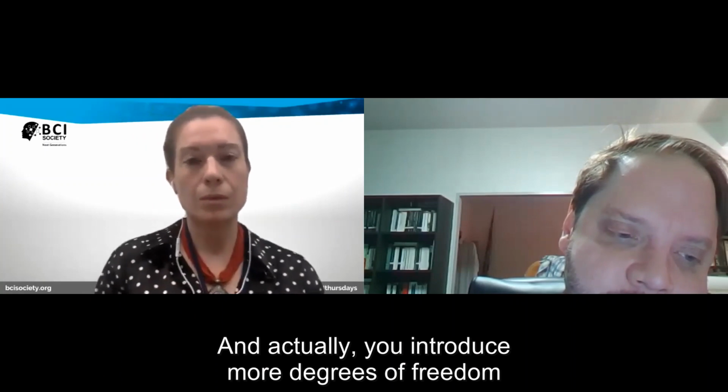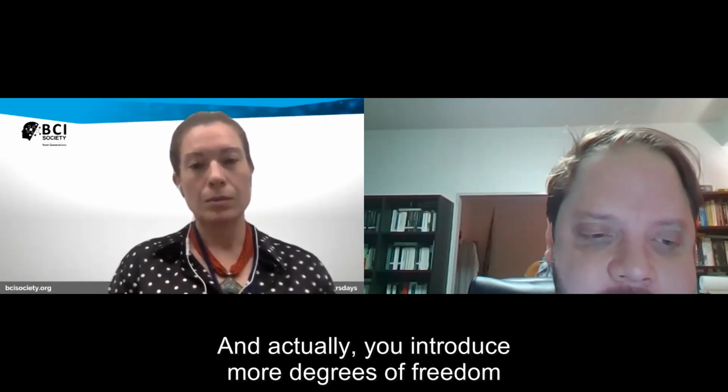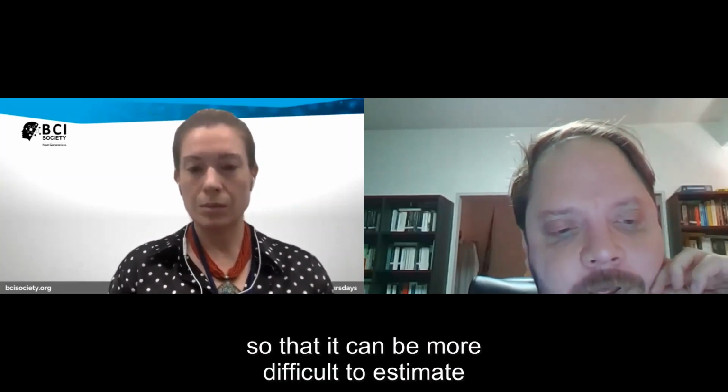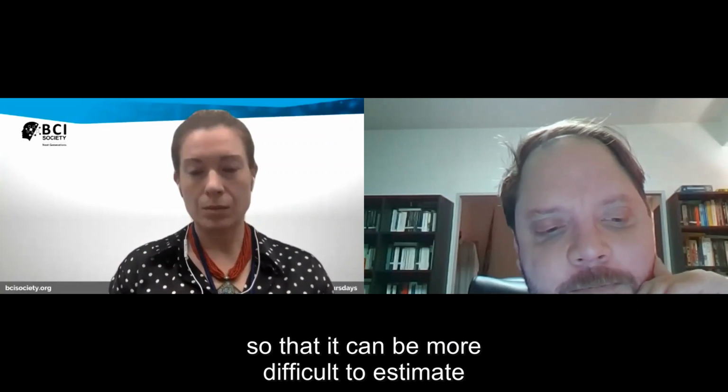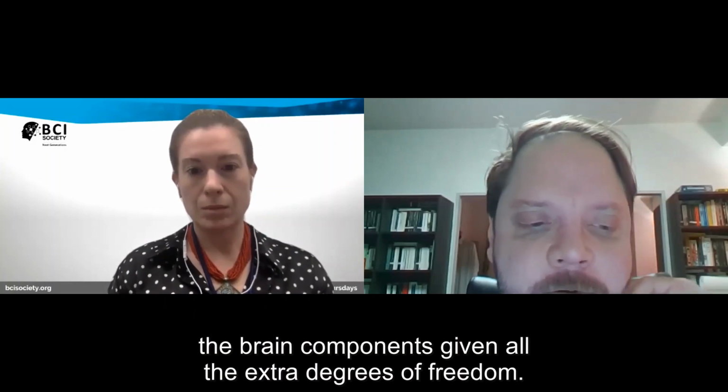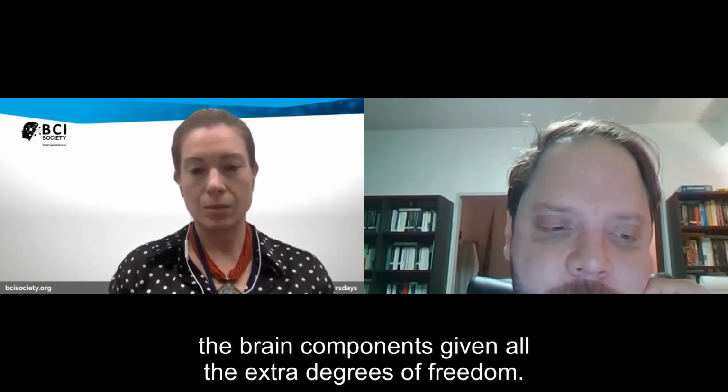And actually, you introduce more degrees of freedom, so it can be more difficult to estimate the brain components, given all the extra degrees of freedom.